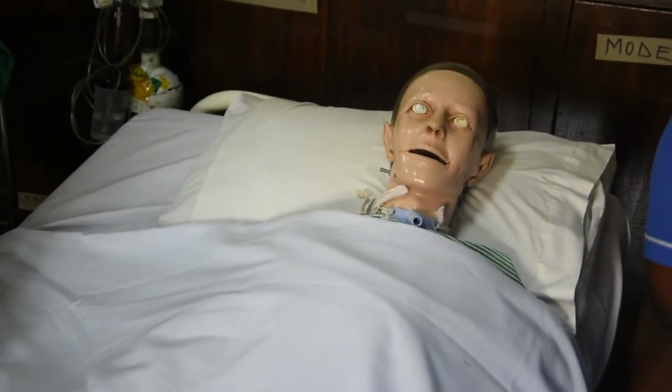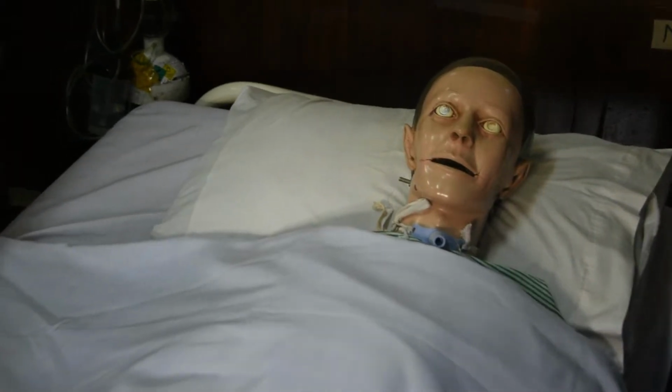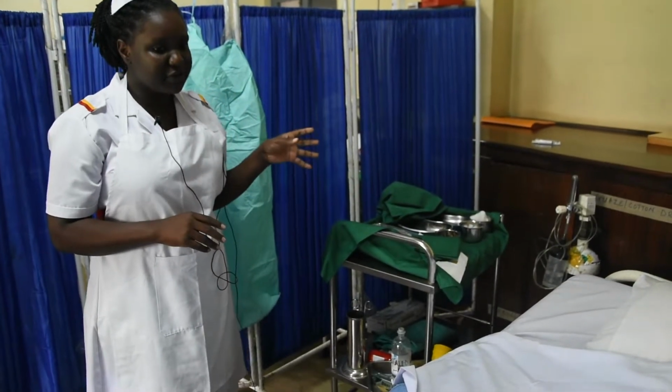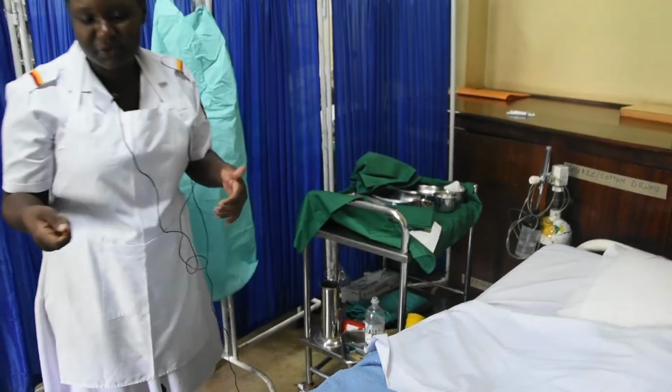So Mr. Mulago, let's first wash our hands before we start on the procedure. Before hand hygiene, we make sure our patient is well. We make sure our patient is screened very well for privacy. So I'm going to screen around the patient, and then we wash our hands. Assistant, come wash our hands.